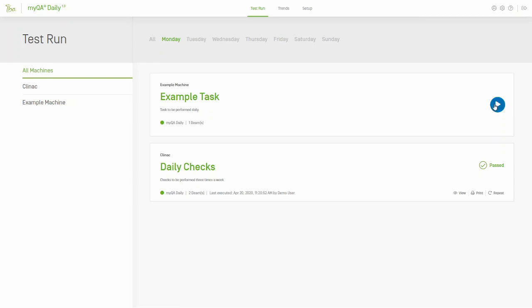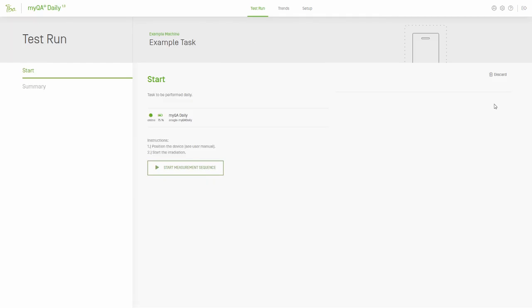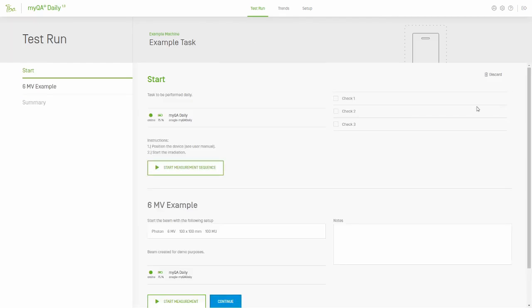Start the task by clicking on the blue play circle on the right. The user will be presented with the go, no-go tests on the right, and the beams to be measured below.